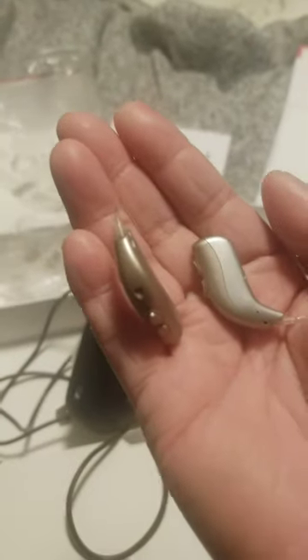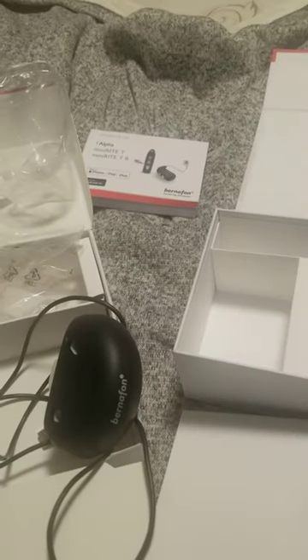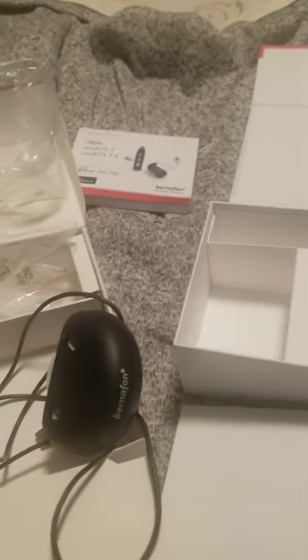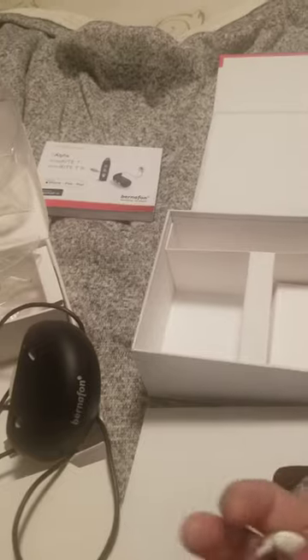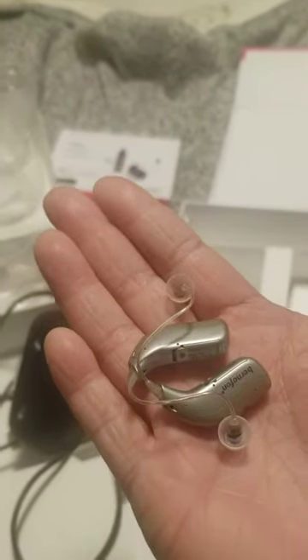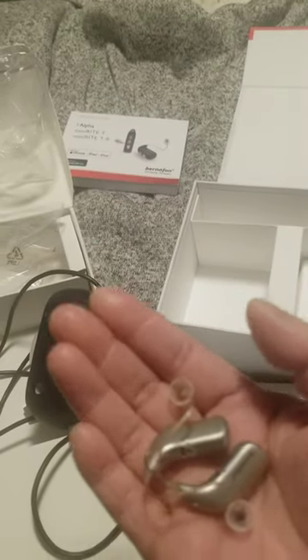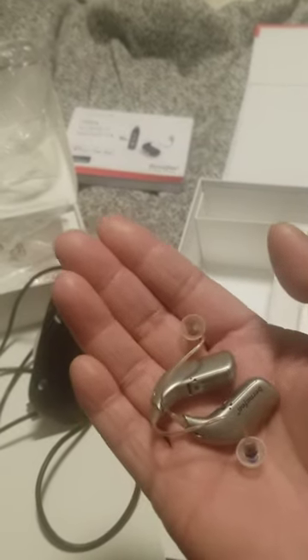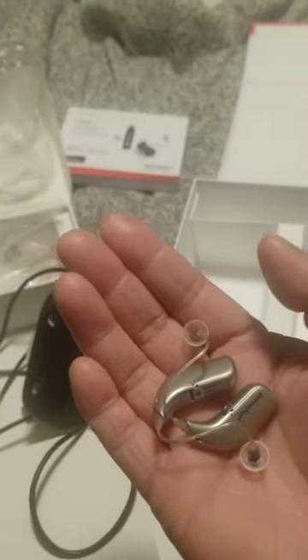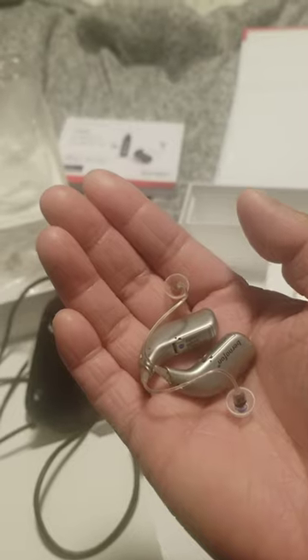This hearing aid is Bluetooth and rechargeable, and they are really expensive. They're Bluetooth — you connect to your phone and then you can change the settings and control the hearing aids.